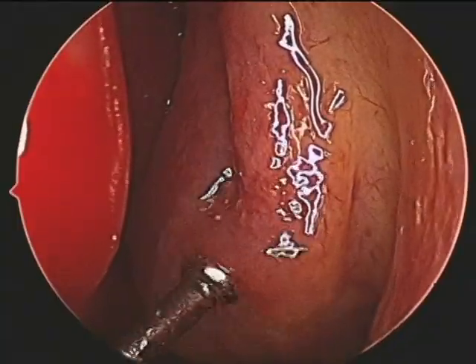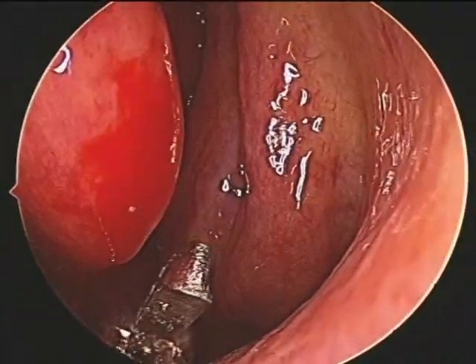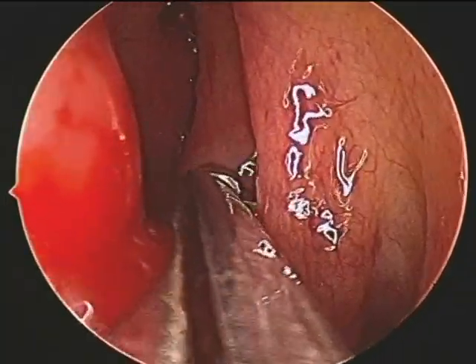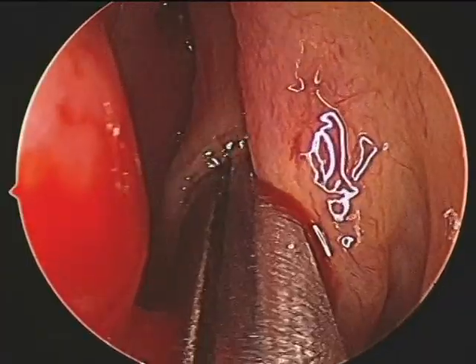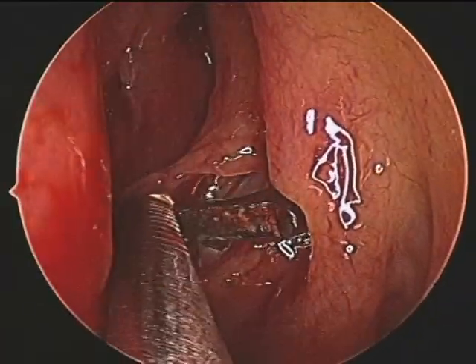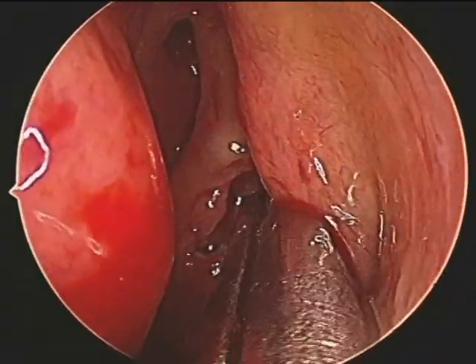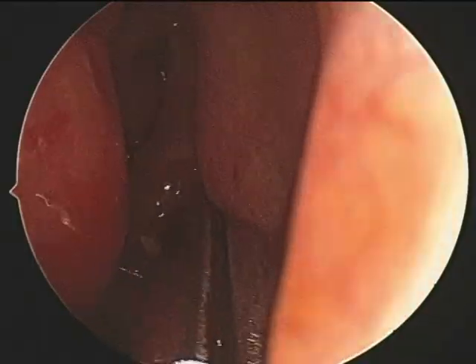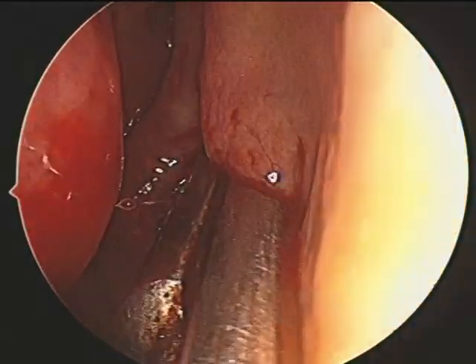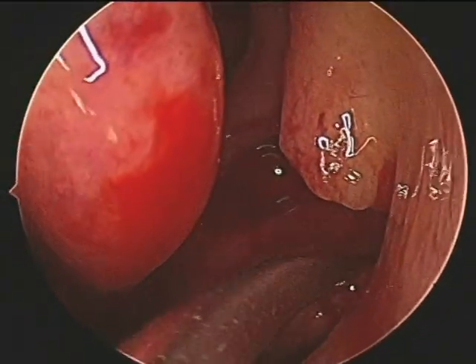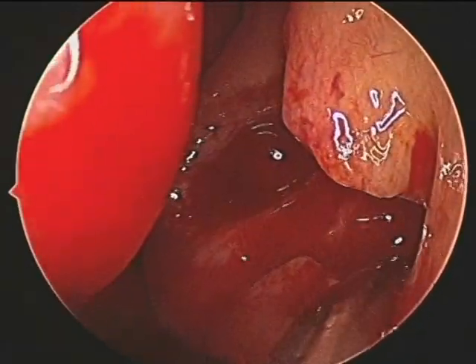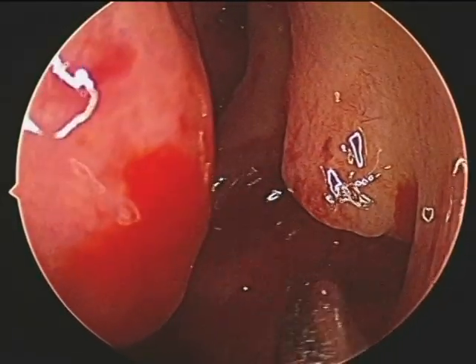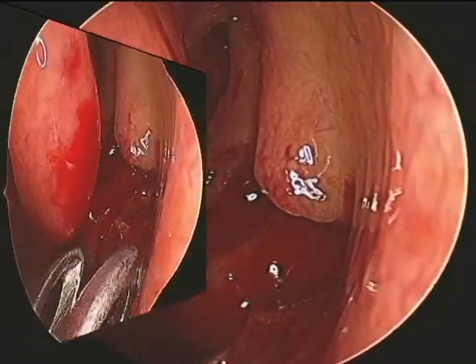This is outlining the everted uncinate process — that is the hiatus semilunaris inferioris. The bulla ethmoidalis and the edematous uncinate process are being highlighted. We begin the process of the left middle meatal antrostomy using a backbiter to create an uncinectomy. We keep biting until we reach hard bone, highlighting the region of the nasolacrimal duct, which we don't want to enter. We then use a ball probe to fracture the horizontal portion of the uncinate process.